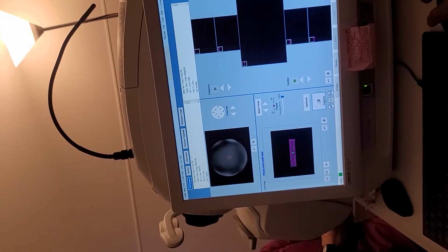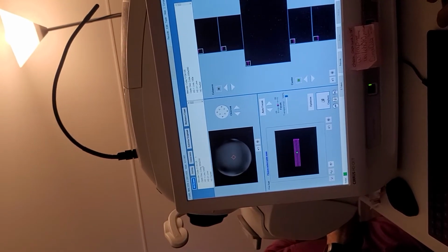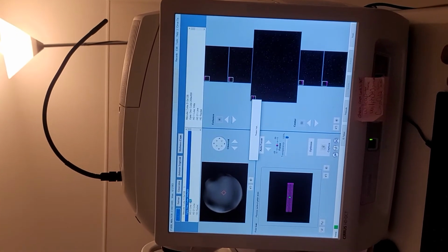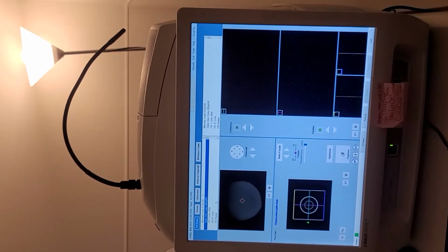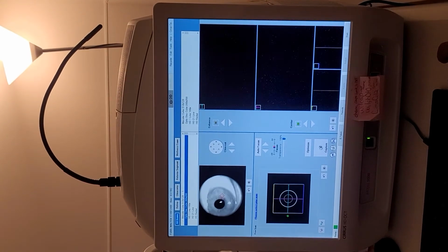If it's necessary, we can have you guys do it because you're training. Not always. The doctor might not order that. Then one time it is necessary to take the optic disc also. But you guys are going to get practice on doing that. Then putting it in center.